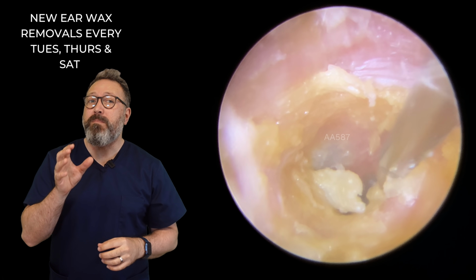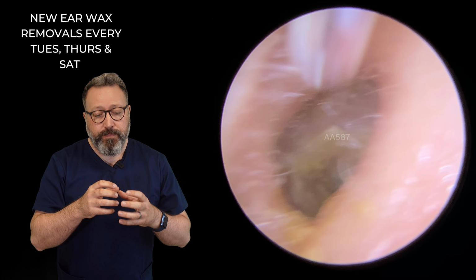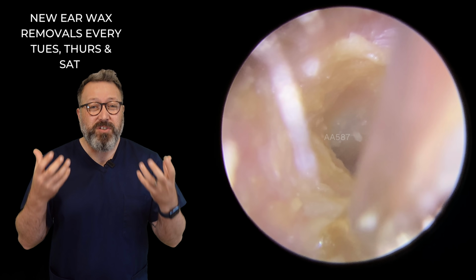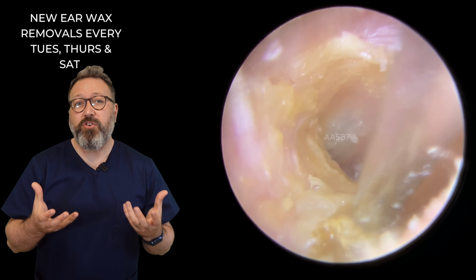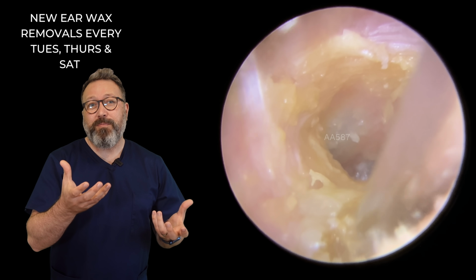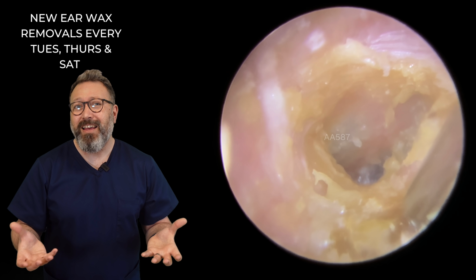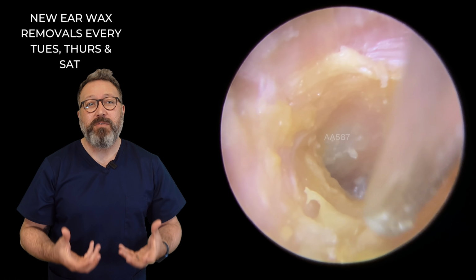Now this particular patient's been back and forth to their doctor trying to get this fixed. Basically, they were in a lot of pain with this, and they've been suffering with a sort of not discharge from the ear, but a lot of pain, lots of irritation with the ear. So the GP assumed it was an ear infection, took a look in there, and then prescribed antibiotics. Now, unfortunately, the problem is that the foreign object was in there, which is what was causing all the pain and discomfort because it was lodged so deep in the ear canal, and all this wax and all this skin had built up behind it that was causing some real issues.